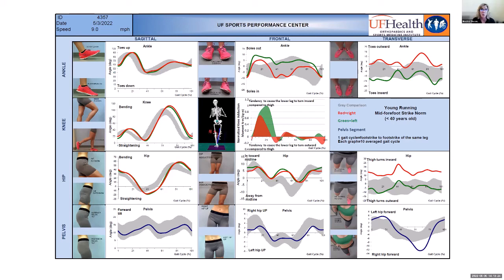Okay. So when I take this whole story from the first page of the temporospatial, the really powerful metrics, to the ground reaction forces, to the motion, what we realize is that we need to have Brady work on trunk control, so less side to side and more anchoring the pelvis a bit. We need to really focus on activating the gluteals, taking shorter steps and really working on parallel feet and softer landings.